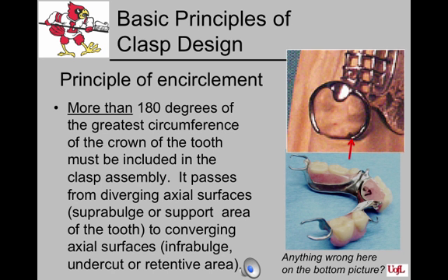The cast circumferential clasp usually encompasses the tooth by about 320 degrees, like we see on that upper picture. Now, on this lower picture, the clasp closest to you on the patient's right side, do you see anything missing there? There's a rest missing, and remember that a clasp assembly has to have the 4 component parts of it. If you don't know what they are, look them back up in this exercise.